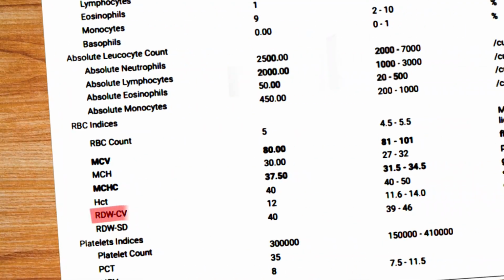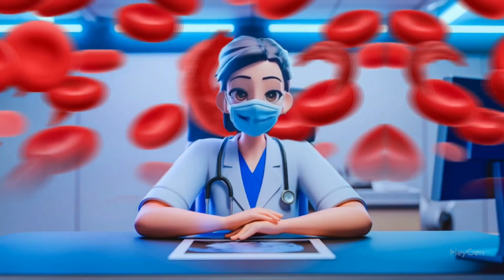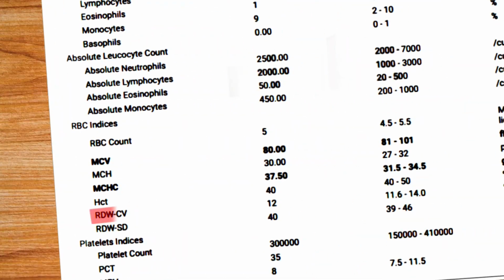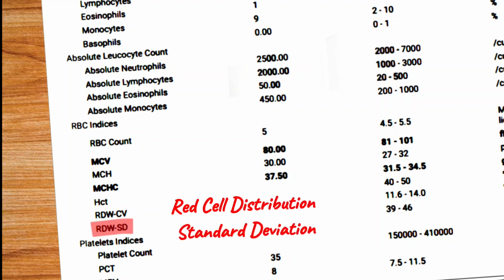Next is RDW-CV. It stands for red cell distribution width coefficient of variation. The purpose of RDW-CV is to measure the variation in the size of red blood cells. The normal range of RDW-CV is between 11.6 to 14%. And another is RDW-SD, which stands for red cell distribution width standard deviation.